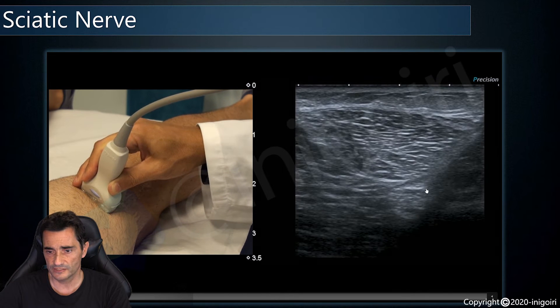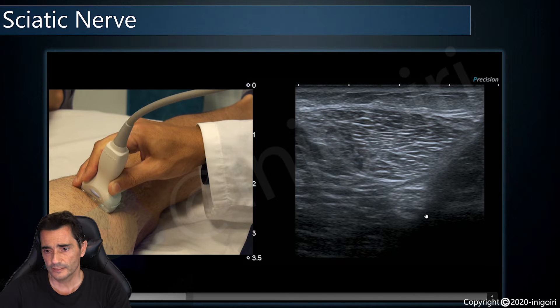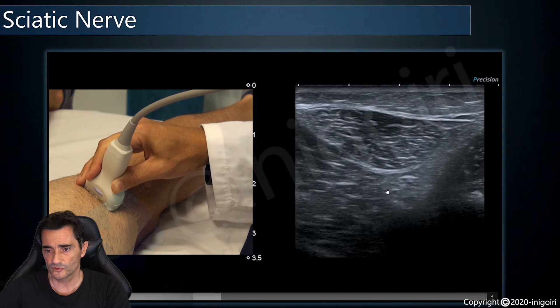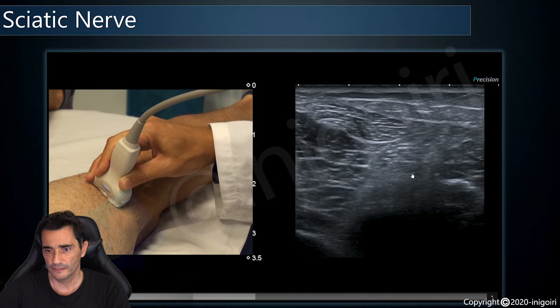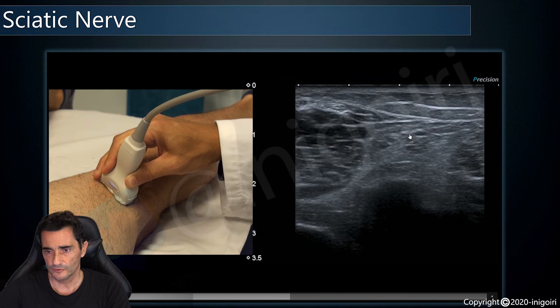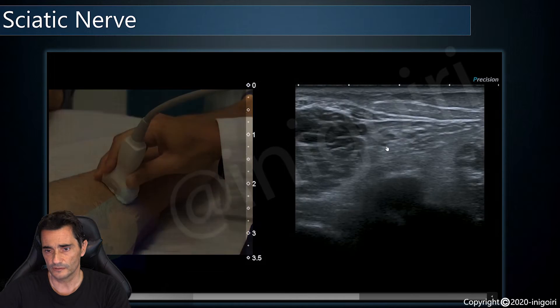So let's take a good look at the video. This is the biceps femoris and this is the sciatic nerve — it's underneath the long head of the biceps. As we go distal, the sciatic nerve becomes superficial and divides here into its branches: the tibial nerve, medial and bigger, and the common peroneal nerve, smaller and lateral.